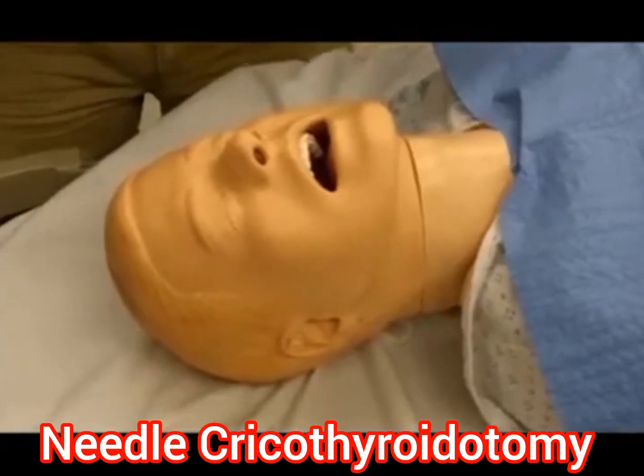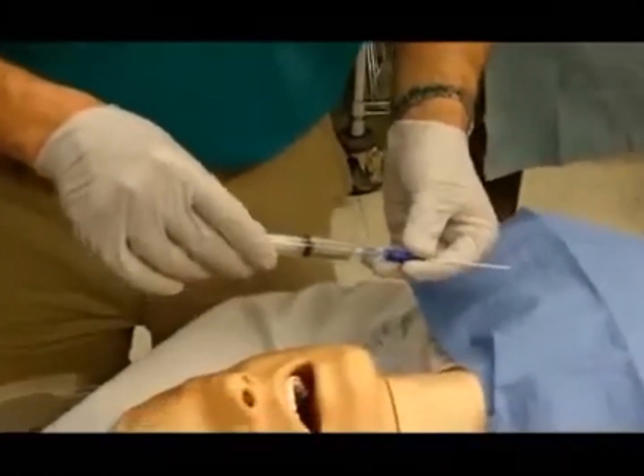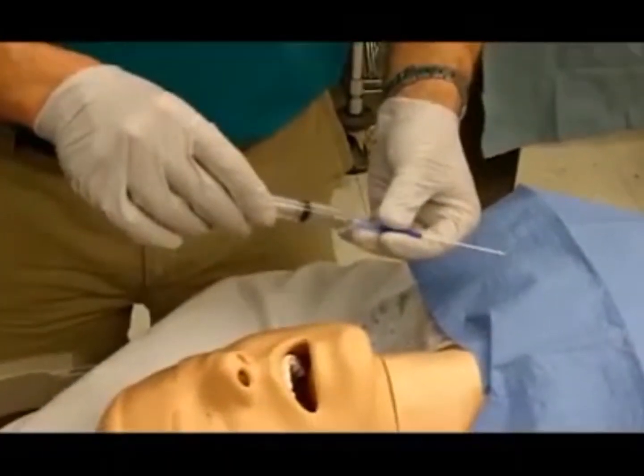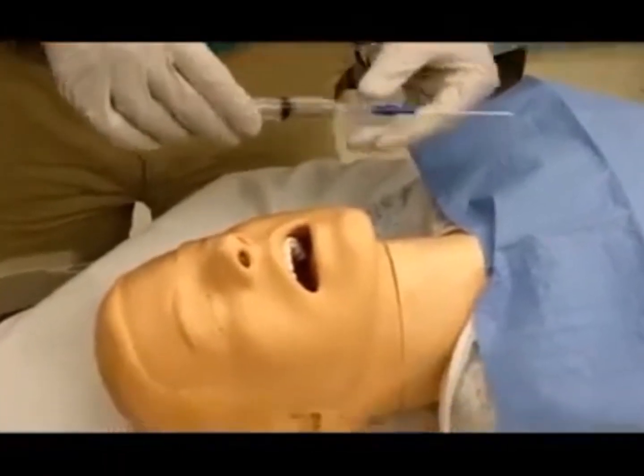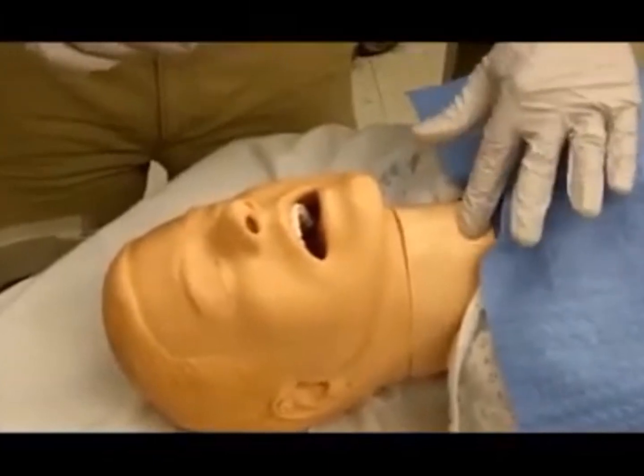Attach a 14-gauge IV catheter to a 10 cc syringe half filled with saline. Identify the cricothyroid membrane. Sterilize the site with betadine.